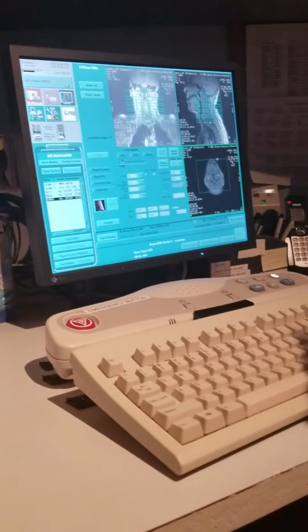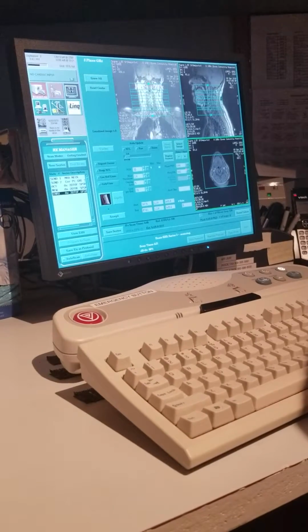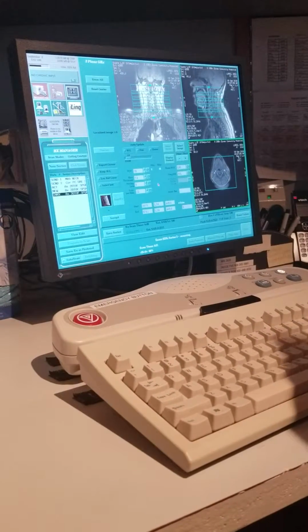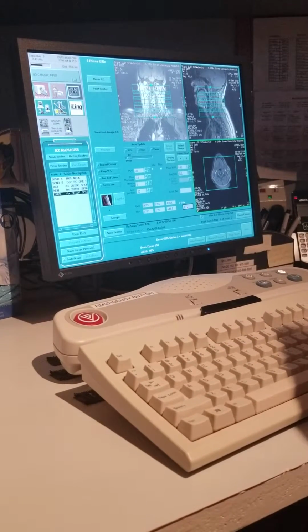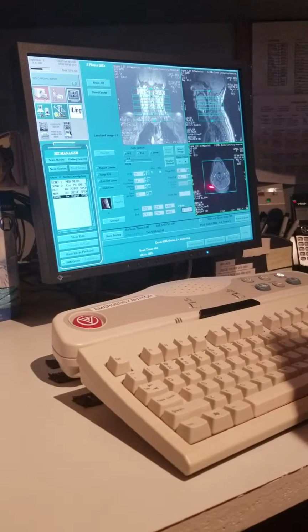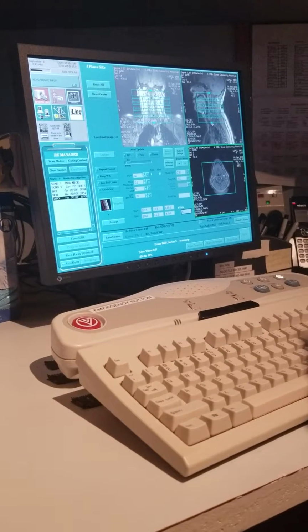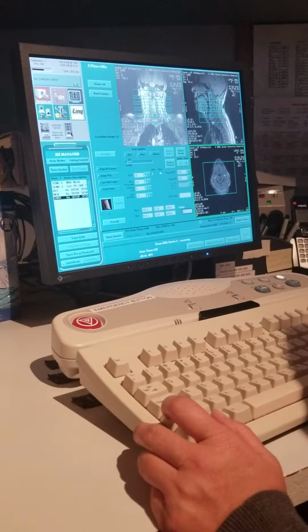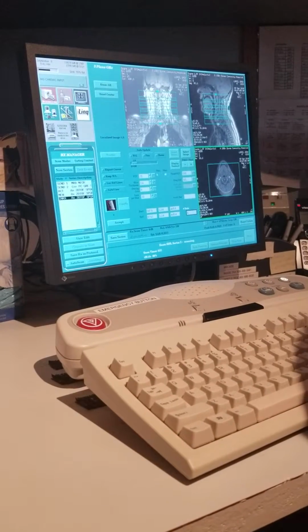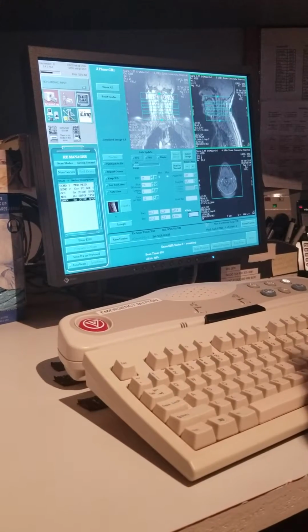Yeah, okay. See, there's your carotid, so you want that center. So what we want to do is eliminate a slab. If you try to do it in here, I don't believe it'll work. If you go from 4 to 5, I don't believe... You know what I mean? So the only way to do it is to shift, click and drag it up on the box. Left mouse click and hold and then drag it up. Drag it up, up, up. There you go. So now you've got 4.